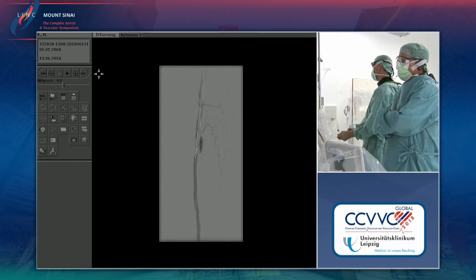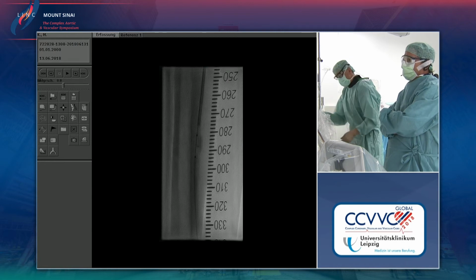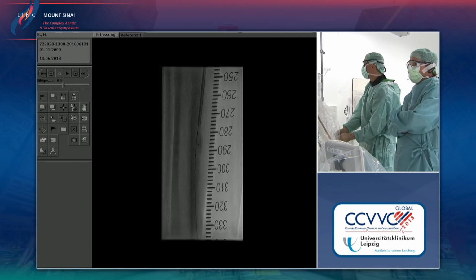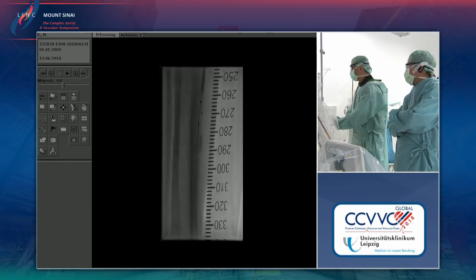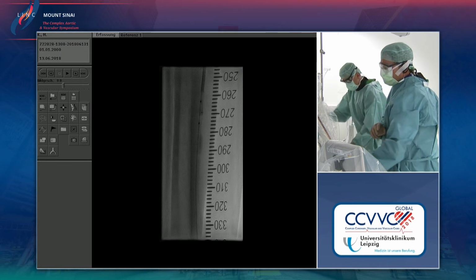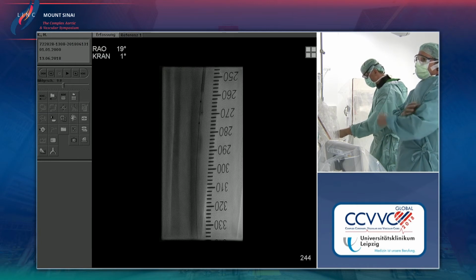Again, sometimes it's only partially successful. Yeah, so I don't think I can do the full treatment here in that time because I probably will do the whole length in that direction and then potentially twist it and go down again.